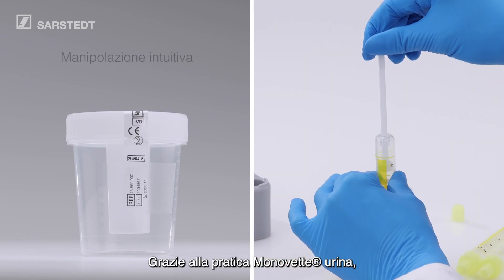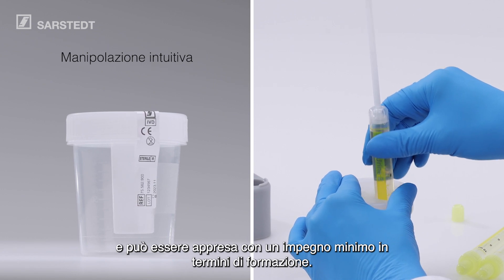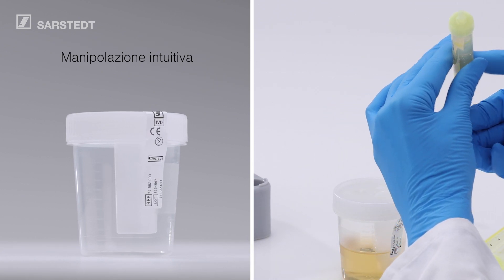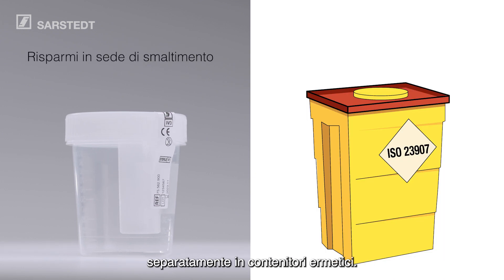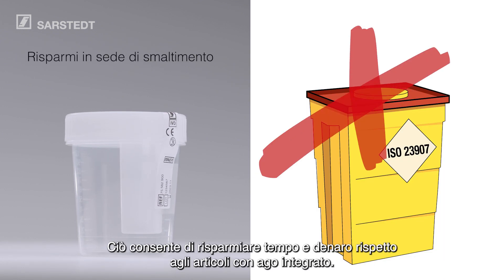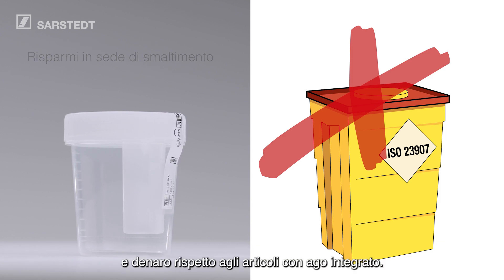The intuitive handling with the practical Urine MonoVet can be learned quickly without extensive training. And after use, NFT system products do not need to be disposed of separately in sharps containers. This saves time and money compared to devices with an integrated needle.